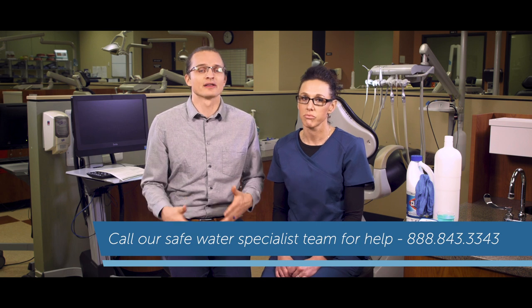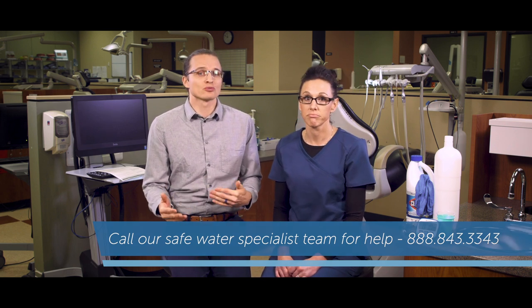Hey there, dedicated dental pros! It's your dental water safety team here at ProEdge Dental Water Labs. I'm Kelly B, and I've got Kelly T next to me — she's the safe water specialist and I'm just the marketing guy. We're here to help you shock your water lines. If you need any additional assistance, you can always give Kelly T and her team a call — they'll be happy to help. Today we're going to teach you how to shock your lines using a diluted bleach solution.